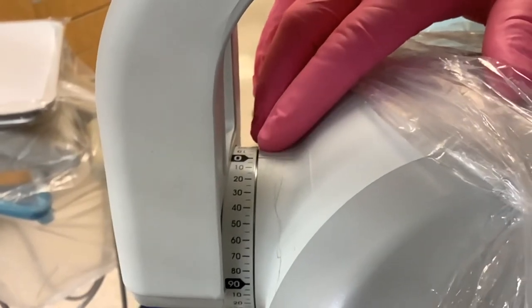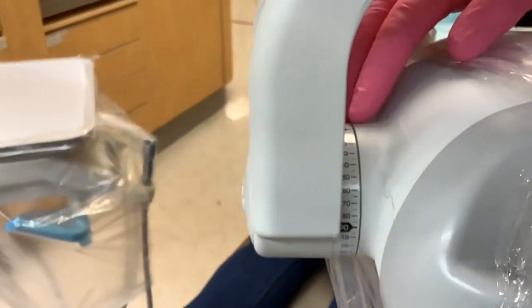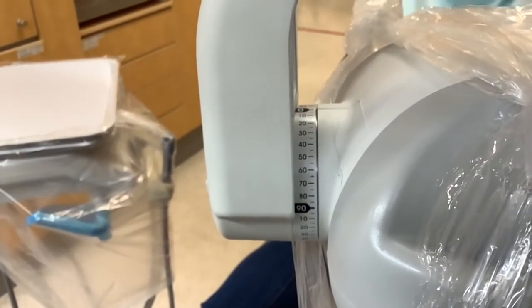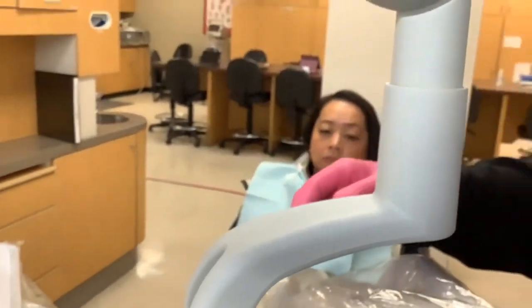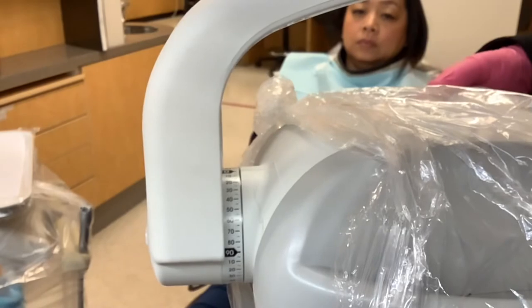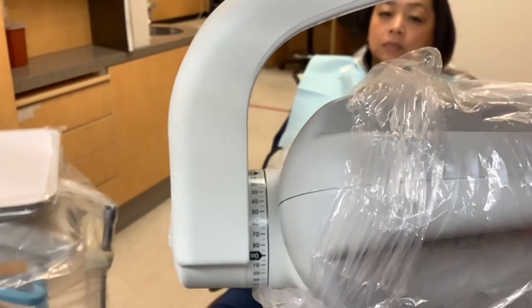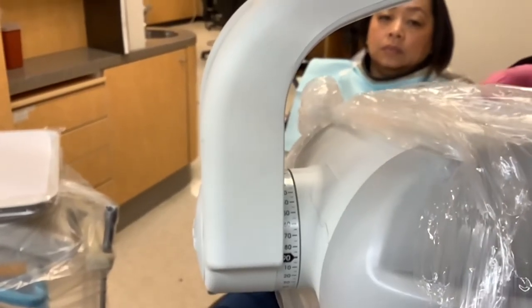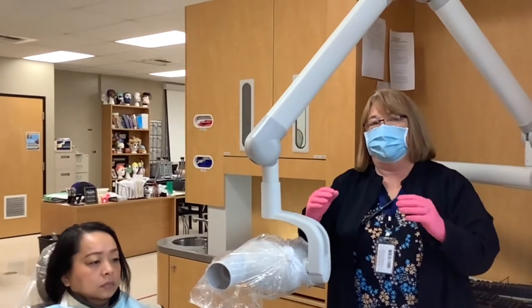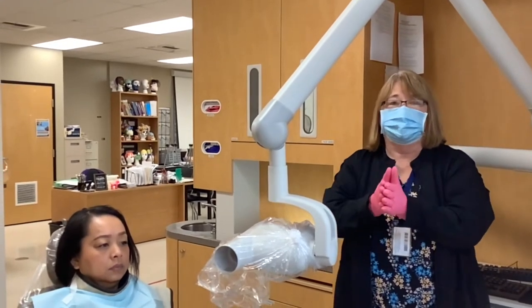Today we're discussing angulation and x-ray positioning. Here is our angulation guide — if a student has no idea what angle to put the x-ray head at, we have to have a starting ground. Zero is our starting ground. If we're going to positive angulation, the x-ray head is pointing down. If we're going into negative angulation, the x-ray is pointing up. Everybody's face is different — round faces, small faces — but in angulation we have to have a starting ground.